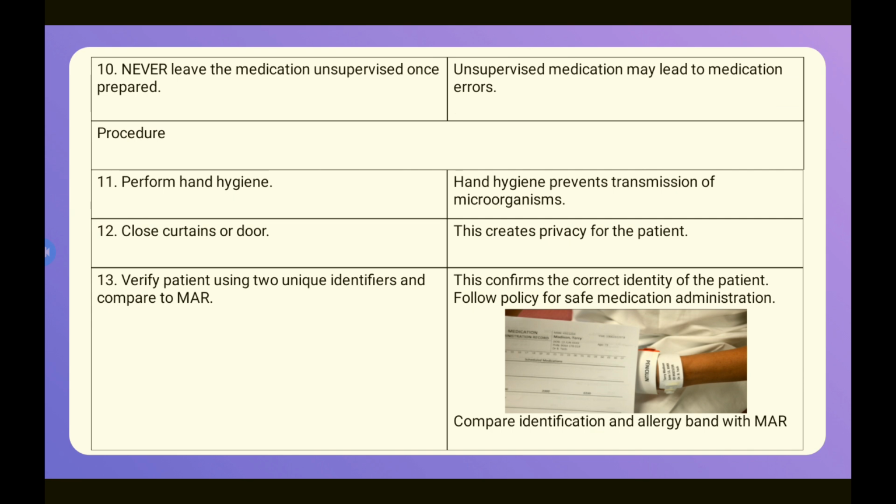Number 10, never leave the medication unsupervised once prepared. Unsupervised medication may lead to medication errors. We will then get into the procedure. Number 11, perform hand hygiene. Number 12, close curtains or doors to maintain the patient's privacy.